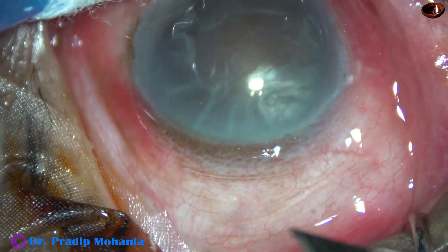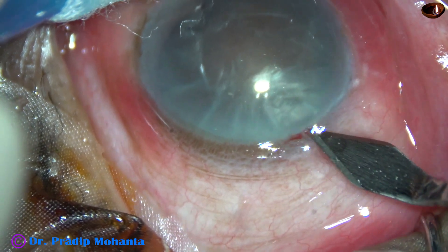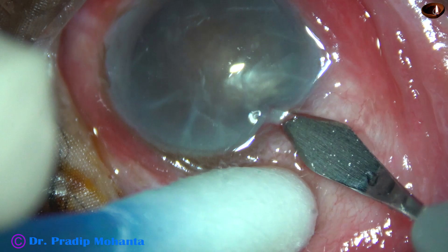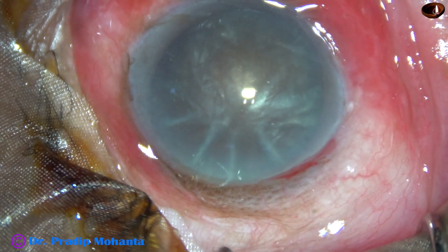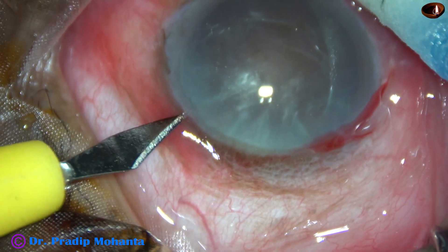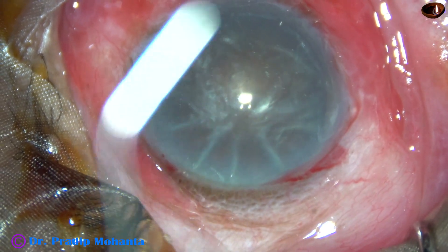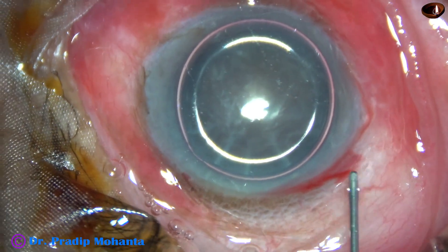This is a 2.8 mm steel keratome. An incision has been placed on the posterior aspect of the limbus. Now the keratome goes anteriorly and then downwards and enters into the anterior chamber. And then a side port is made on the left side of the main incision, about 2.5 hours away.